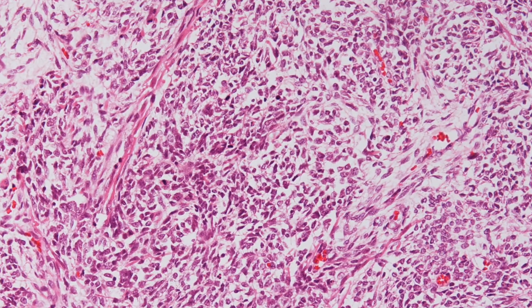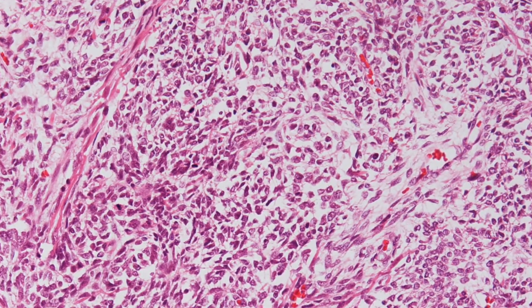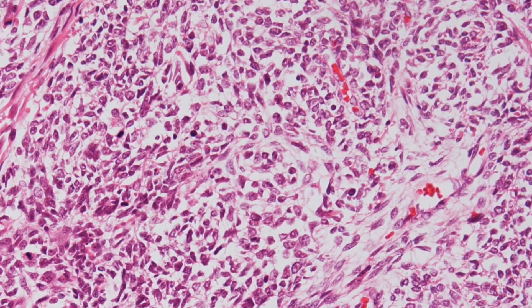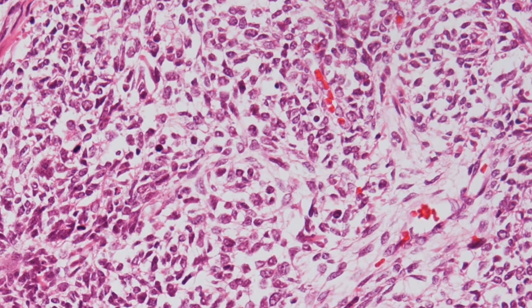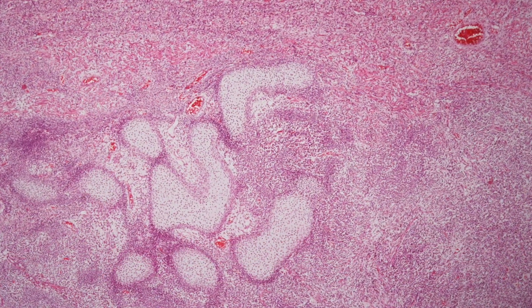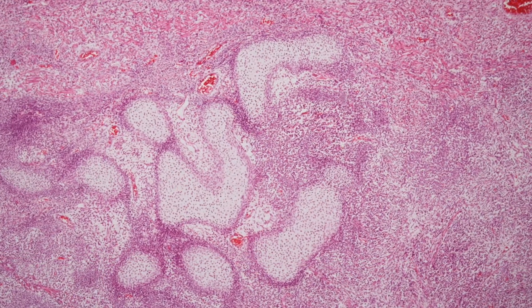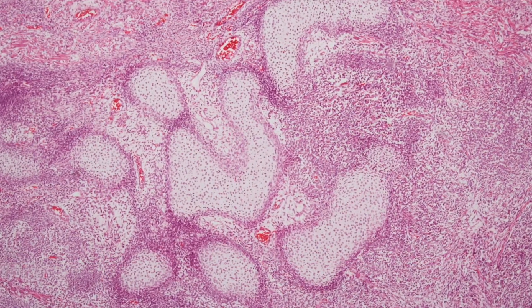This is a typical field of the lesion. Here is another field. What is this tissue type we are zooming into?